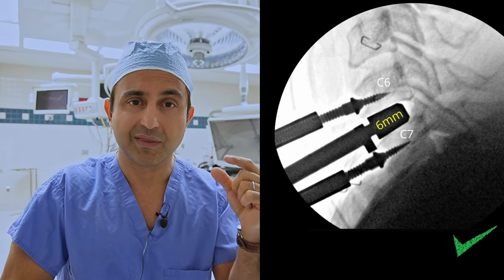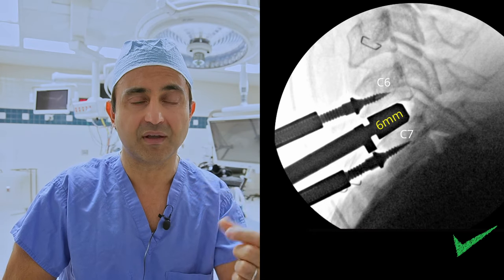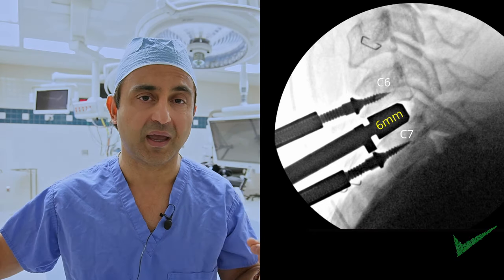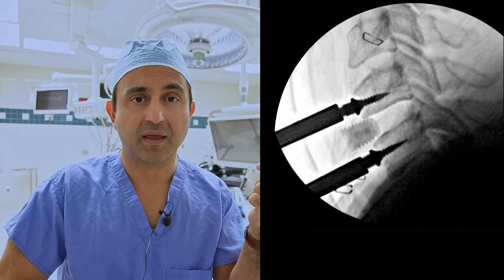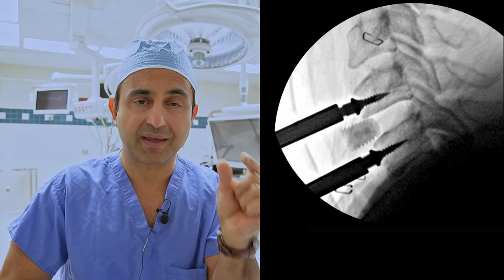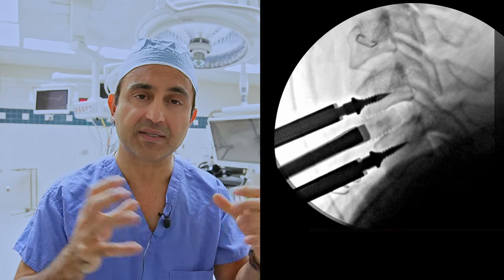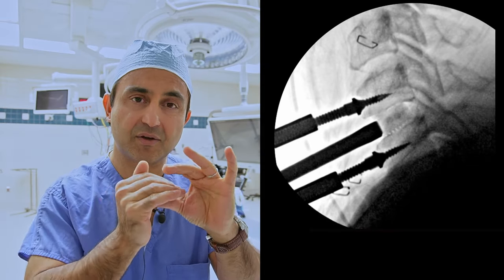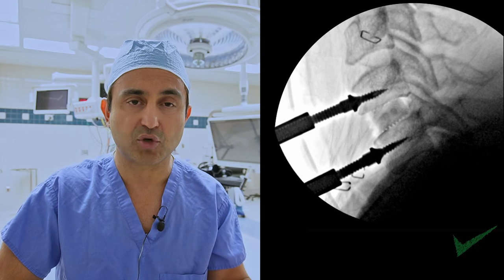In the case of this patient we used a six millimeter spacer, which gave us a very good snug fit both by tactile feel and by looking at it from the side on x-ray. Next we remove the trial and select a piece of cadaver bone graft called an allograft, and gently tamp it into place until the bone is in the center of the disc space. At this point you check another x-ray to make sure everything looks good.